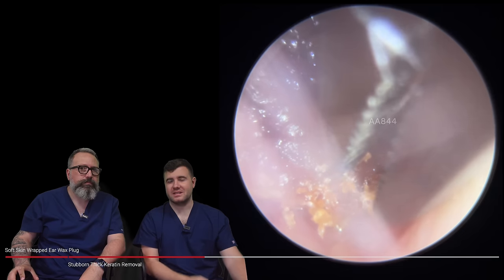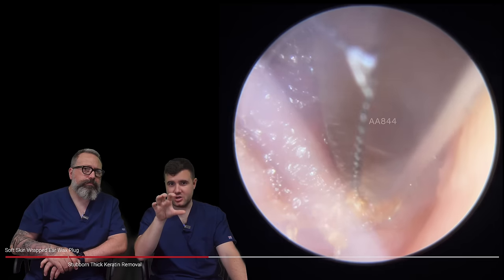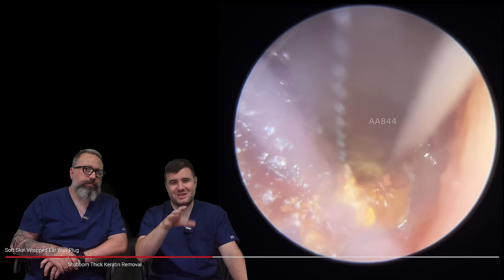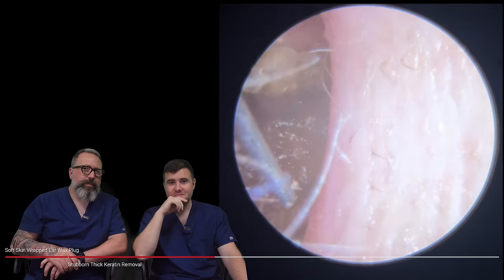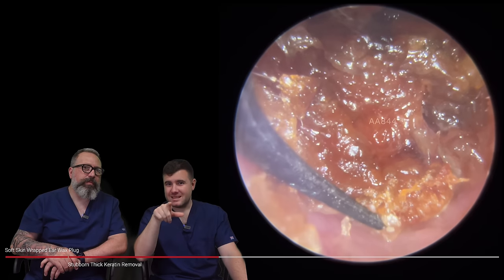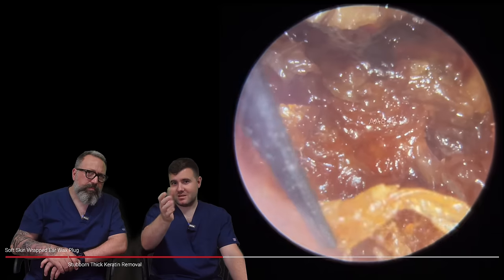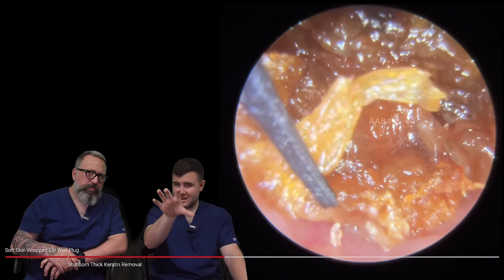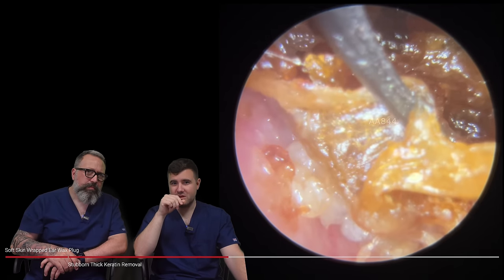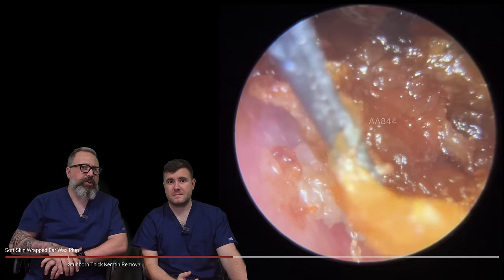I popped the rosin inserter in gently just to try and reposition the bottom edge of this skin plaque, to try and get a better grip with the forceps. But you could see I tried to get a grip and it just pushed it back into position — really frustrating. Especially when it's right up against the eardrum, you're always a little bit more cautious. The smaller rosin inserter would have been perfect here because the side of the larger one is almost touching up against the ear canal wall. I think the manufacturer has just changed their design for some reason.